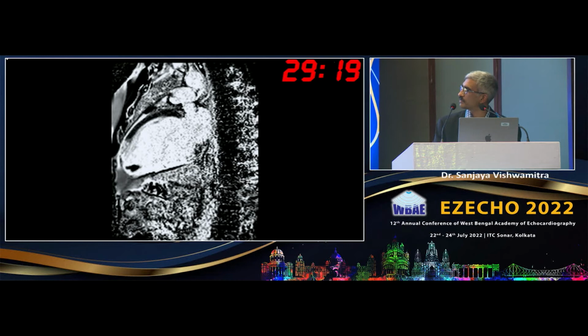And you can see here on this particular image that area which was in the left ventricular apex is showing no delayed enhancement. It's within the cavity, and that's just a nice example of a large thrombus within the left ventricular cavity. And you can again see the transmurality of the infarct in the distal LAD territory that you're seeing here. So with that, I thank you for your attention, and I will stop on this particular case.